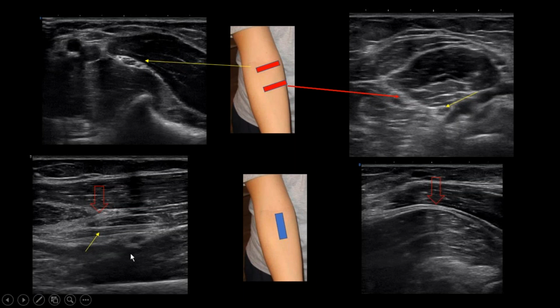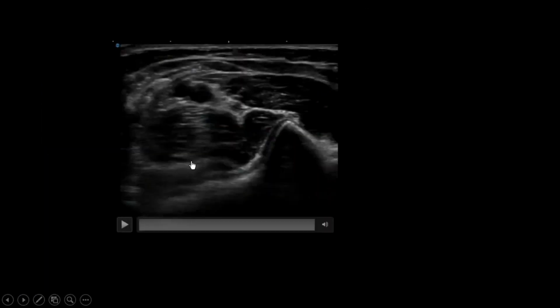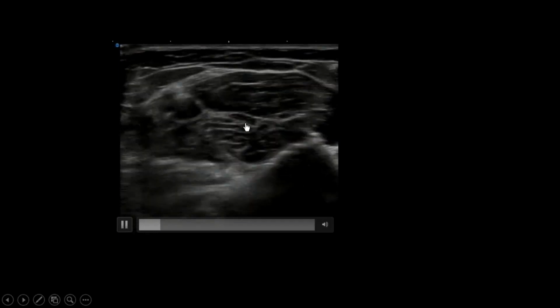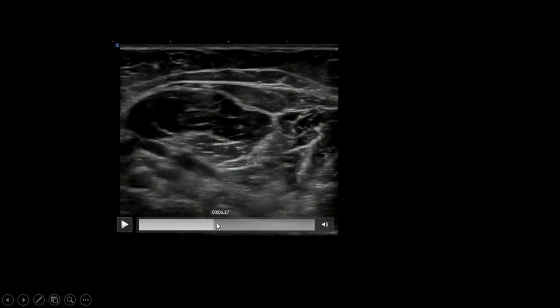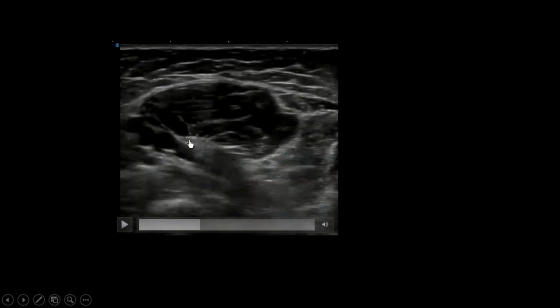Now in the long axis view, you can see the main trunk of the median nerve, and that's the anterior interosseous branching. And here the focus is on the anterior interosseous nerve, so you can see the nerve very nice and clear. And after that, it innervates different muscles here, so it branches off, and it's hard to follow in long axis. Let's look at the main trunk of the median nerve. It's flattening, branching, and right about here is the small anterior interosseous branch.